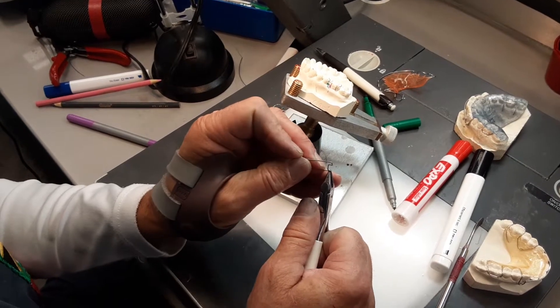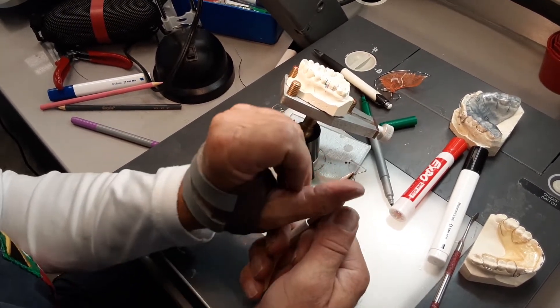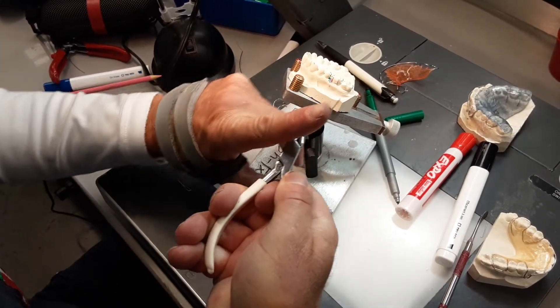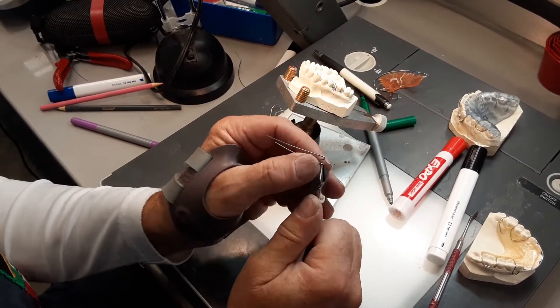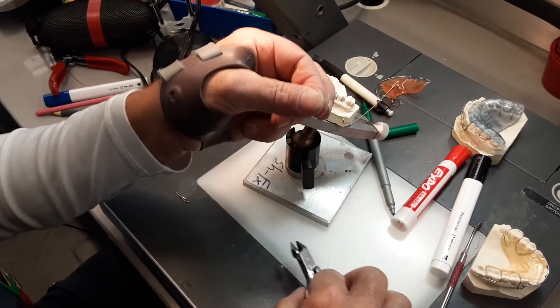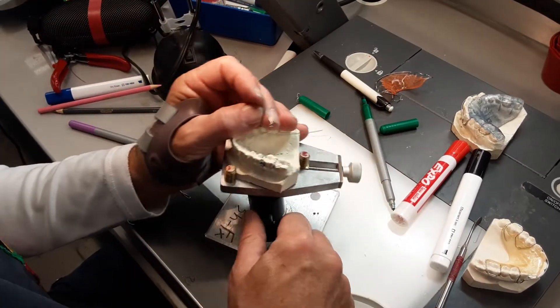Now I'm going to take the round beak, put it inside the eyelet like that. I've got this angled a little bit that direction — I have the buckle bar at about 30 degrees to my pliers — and I'm going to bend that back 90 degrees. Nice 90 degree bend there, and I'm going to put this onto the model into my preparations.